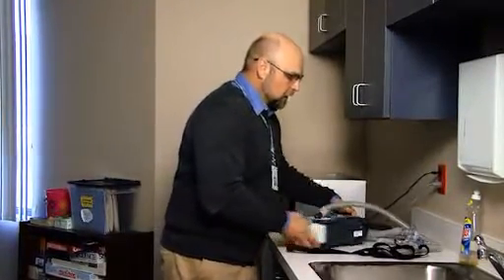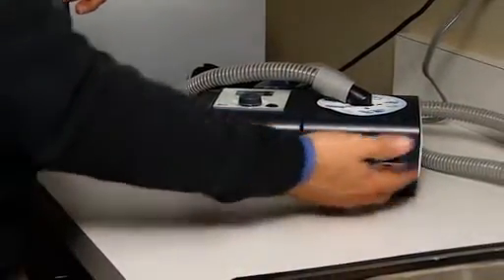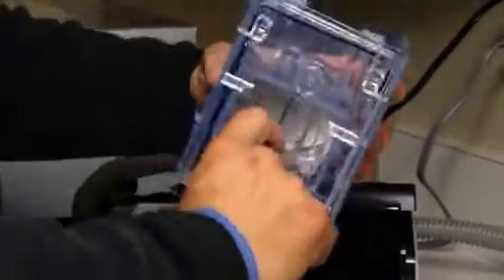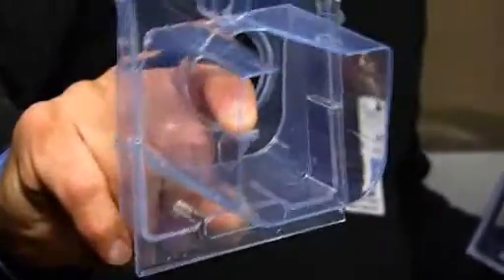Then the humidifier chamber is in the front, and to get into it, you simply lift it under the lid here, put your finger in here and slide it out. Now the trick to getting water out of this and opening it up is there's a little tab in here, and you just push down on it, and this actually hinges out. And if you can get a close-up of that, maybe. See how that's actually squeezing down? That's the trigger that opens it up.